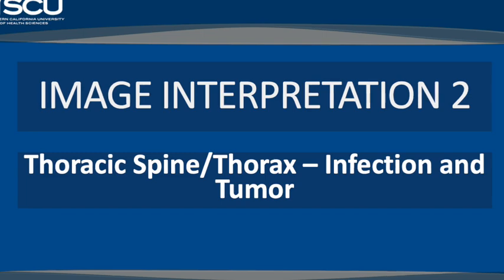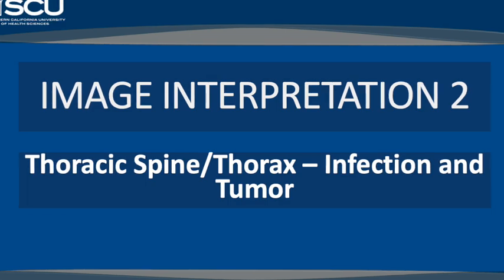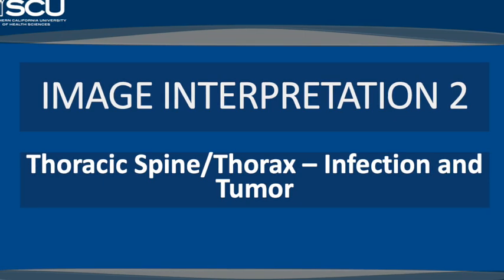our diagnostic arsenal. To further solidify our understanding, we have visual representations of both monostotic and polyostotic fibrous dysplasia. These images serve as valuable resources, aiding in pattern recognition and enhancing our diagnostic acumen.